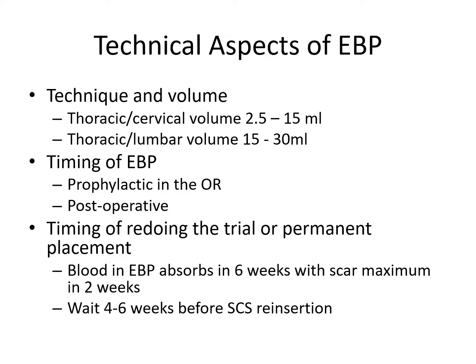Timing of the epidural blood patch is also of concern and can be done in the OR or in the postoperative area. Timing of redoing the trial or permanent implant is also of concern. Blood in the epidural space absorbs in about 6 weeks with scar maximum in 2 weeks. Therefore, it's recommended to wait about 4 to 6 weeks before spinal cord stimulator reinsertion.